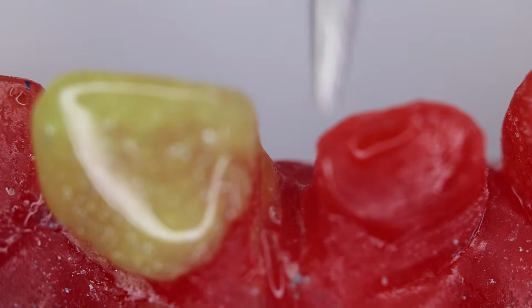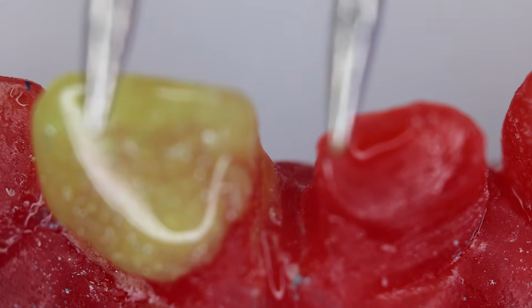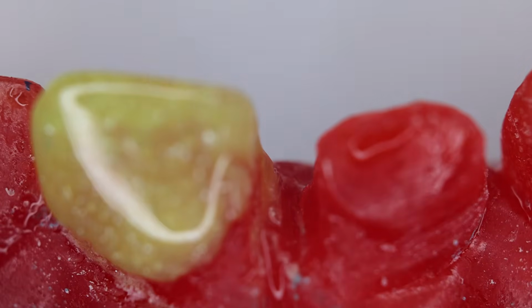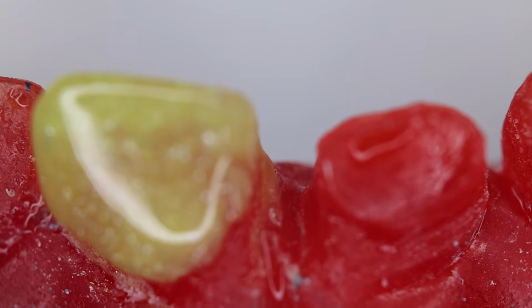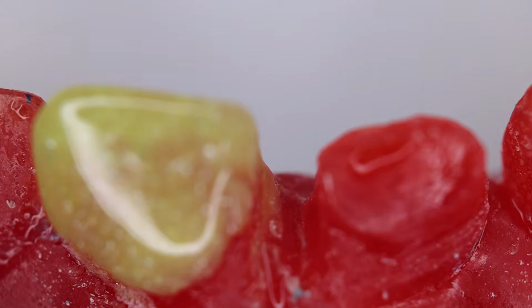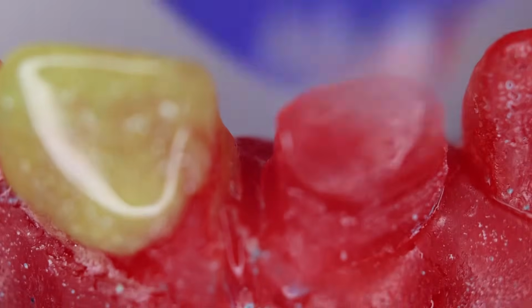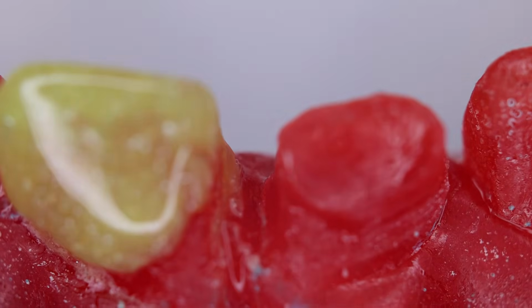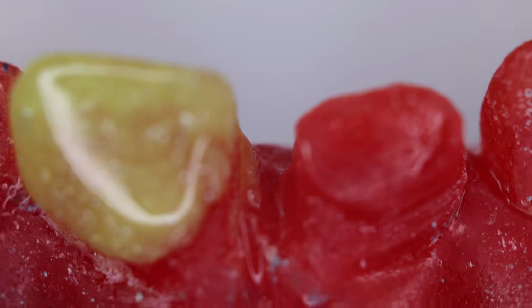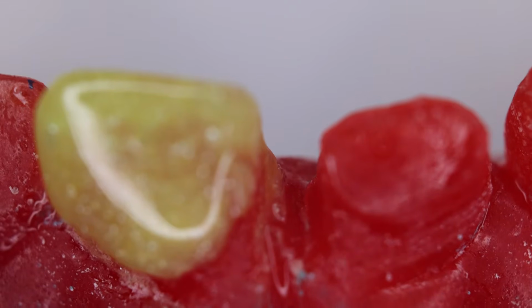Otherwise, if both the teeth are decayed or have lost their anatomical aspect, then we need to just select the crown from the crown kit and identify which crown is going inside. For that we just insert the crown and see how much it can go inside. Otherwise, the average mesodistal width of the crowns can be considered based on the text.